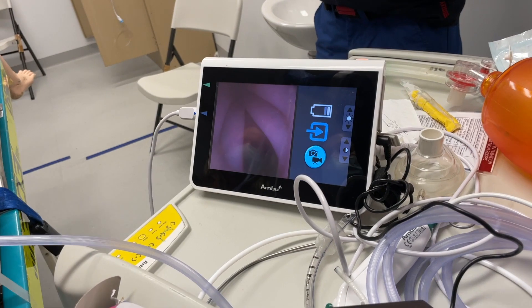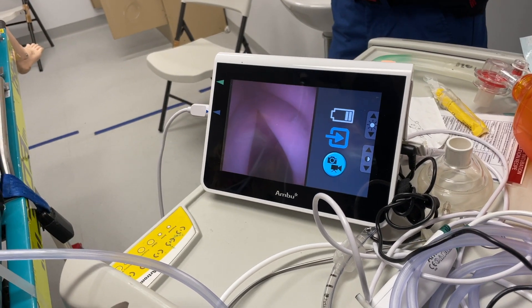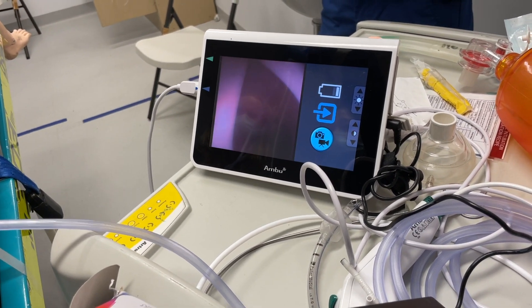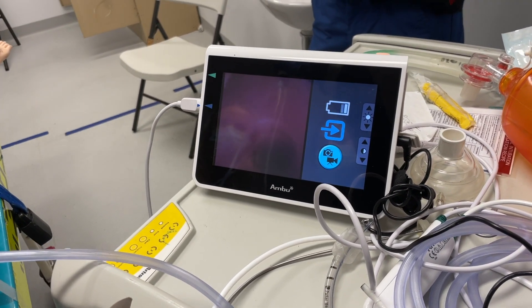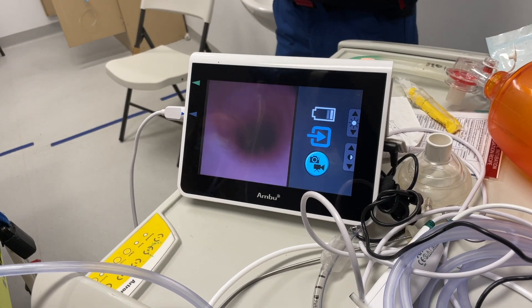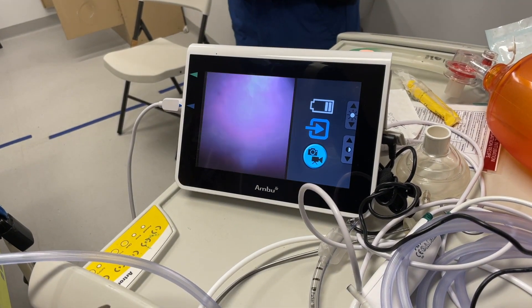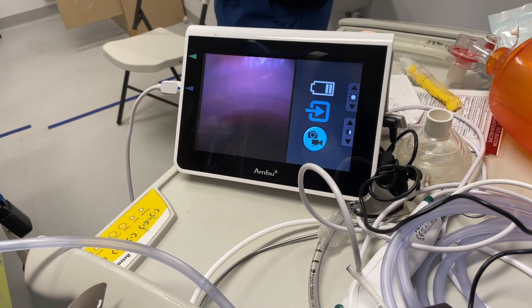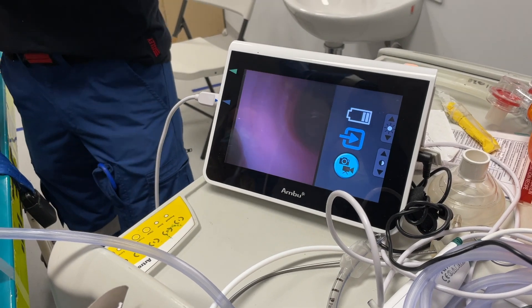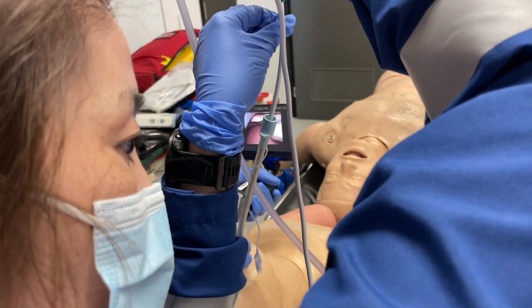Once she's gone behind the epiglottis, we switch our eyes to look at the flexible scope screen. We can see the entrance to the airway, the larynx and vocal cords. We'll go all the way down to visualize the carina — or carina, depending on which continent you live on — and then pass the tube over.